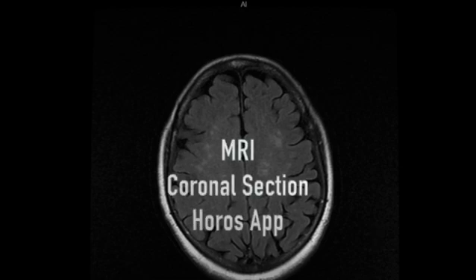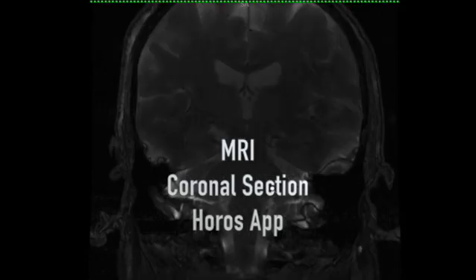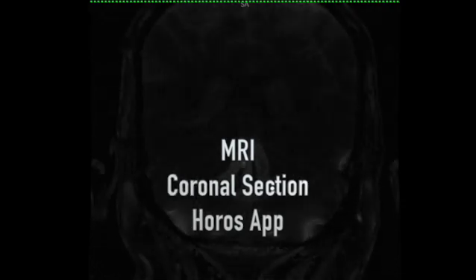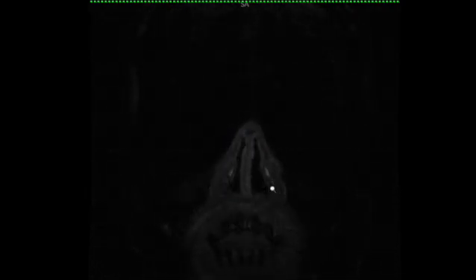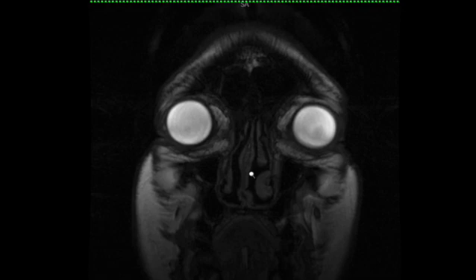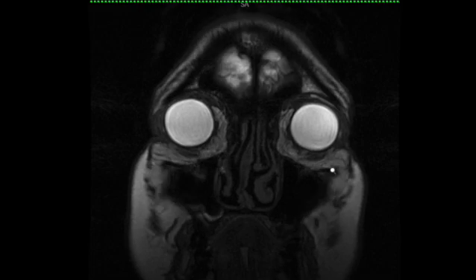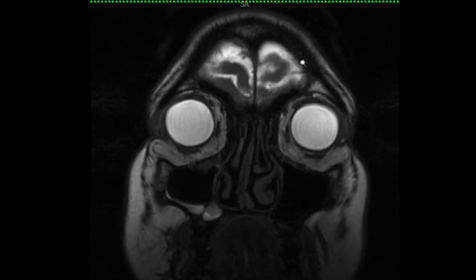Looking at the images, let's look at the coronal section. I am using the HOROS imaging system where I read the files. On the coronal section, as I proceed further, that's the septum. Remember, water is white on T2, so the vitreous is white in color. As we proceed from anterior to posterior, we can start seeing the CSF in the brain, which is hyperintense.